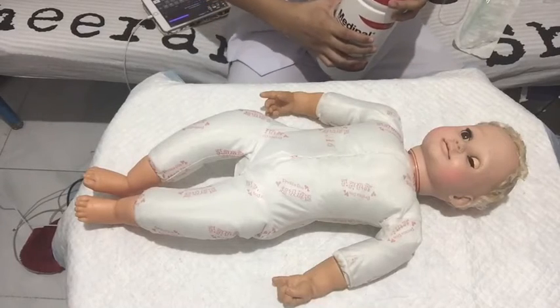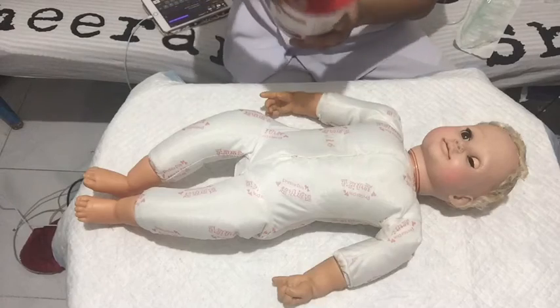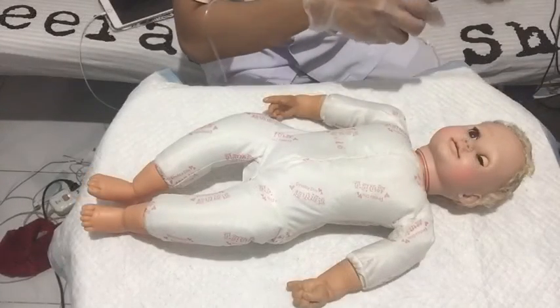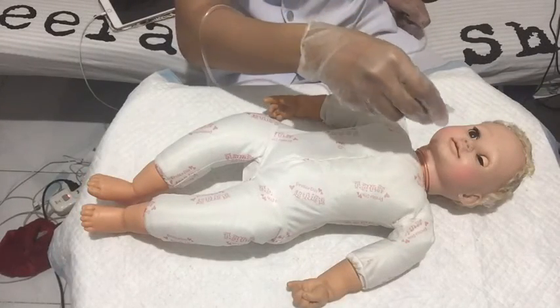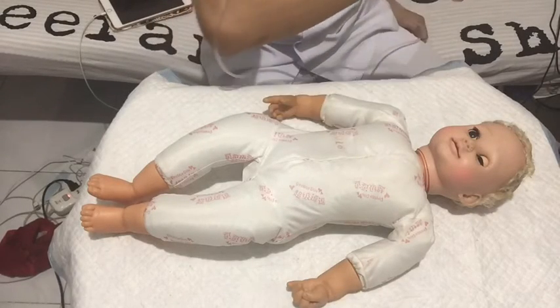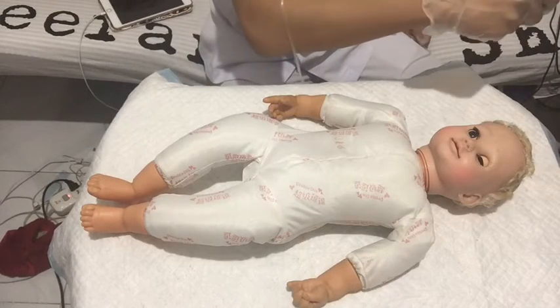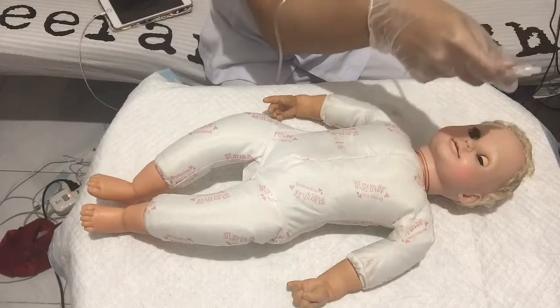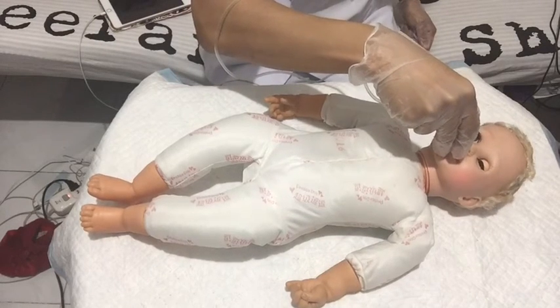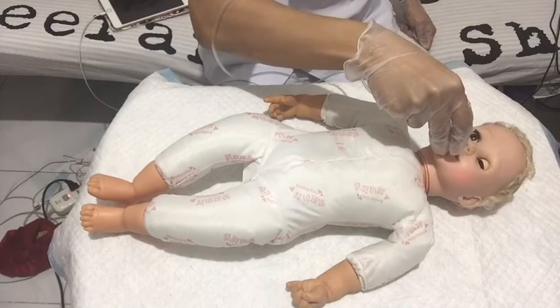We should also replace the oxygen device on the newborn. When the baby has a hard time breathing, in case the oxygen runs out, we're going to have to replace the oxygen delivery device on the newborn baby. This is a makeshift one. You can ask assistance from a nursing assistant. Now what we have to do is clear secretions. You should always use the sterile water to clear out the suction and keep the tube patent. Then we're going to repeat the process until we remove the secretions. And we have to observe the changes in the cardiopulmonary status of the baby.